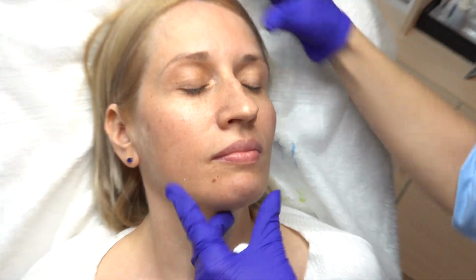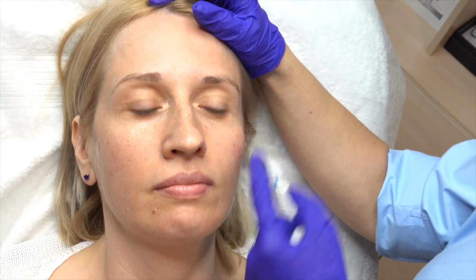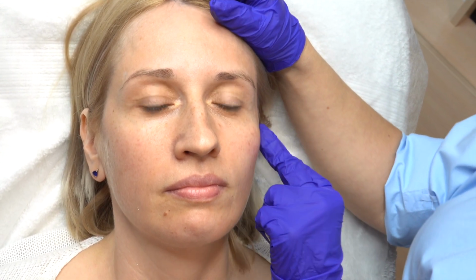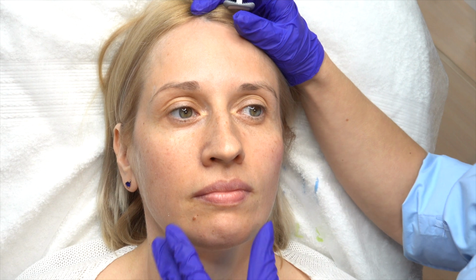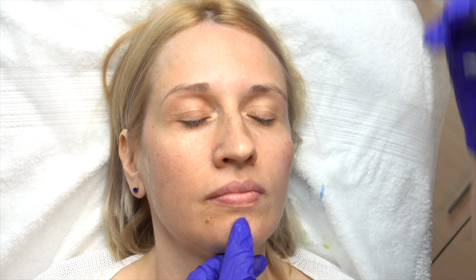You already can see beautiful definition. We already did the apex of the cheeks. We improved these unwanted shadows. We improved this nasal orbital proportion, nasal facial. We improved these proportions. And now I want to go to the chin and add to the central part of the chin.